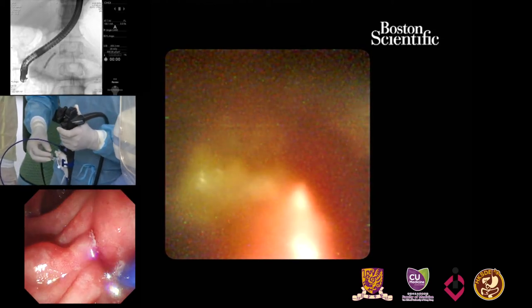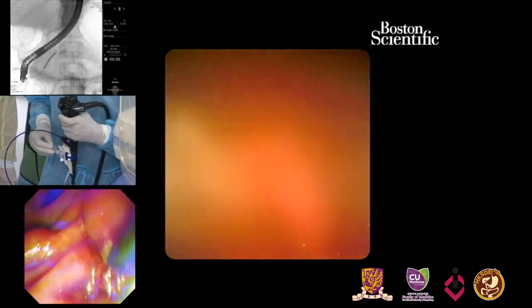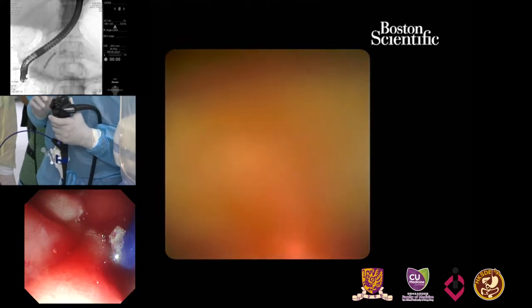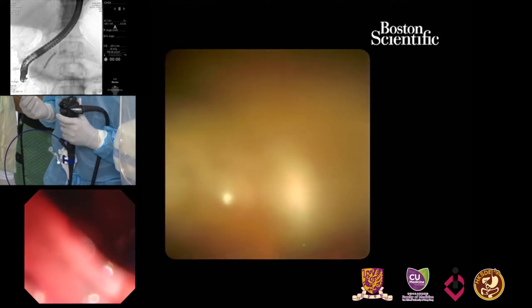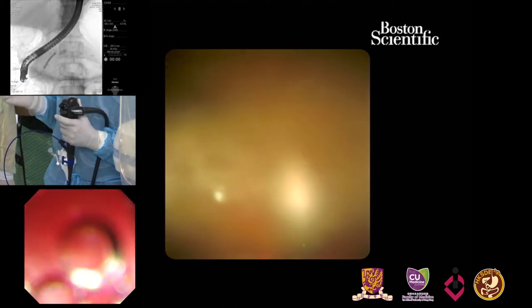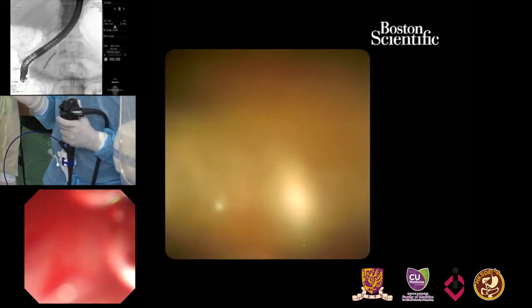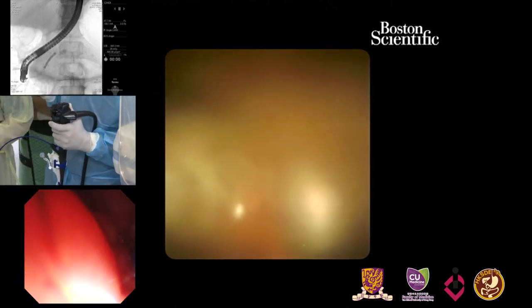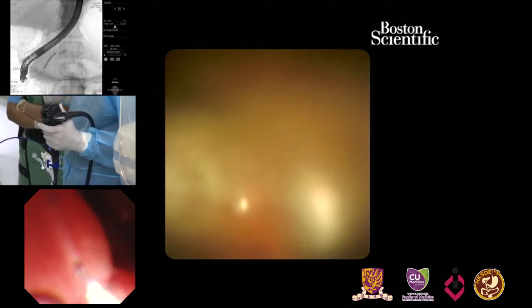So now, I'm just thinking that we have done a lot of this procedure with a lot of saline infusion. So we don't want to cause more problems for the patient. So ideally, I think what we should do now is to exchange the laser fiber for a guide wire, the same guide wire that we used, and put in a stent. And then the fragments come out, and then you invite me again for the next workshop.